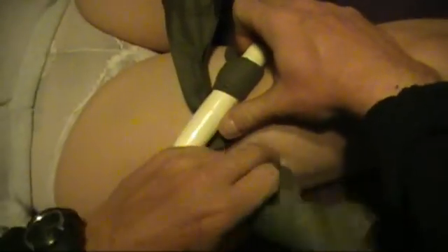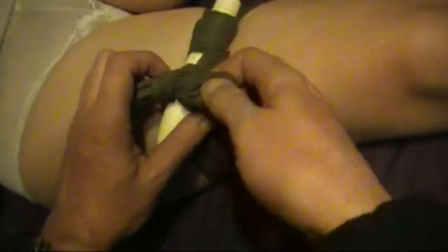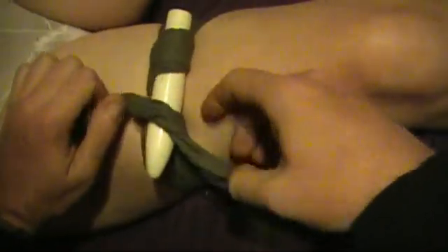Now, once you get it cranked down, this is where your knot comes into play. Make sure your windlass is long enough, okay? And then you go and you tie this around, like that. And now it's secured my windlass. It's preventing it from unraveling. And the bleeding has stopped. And that's about it.